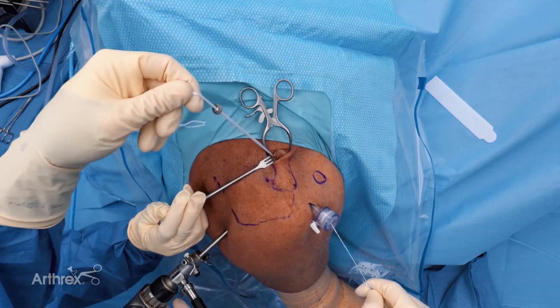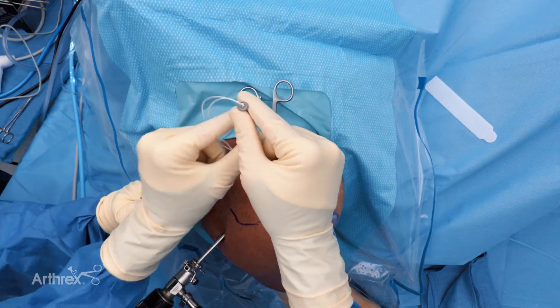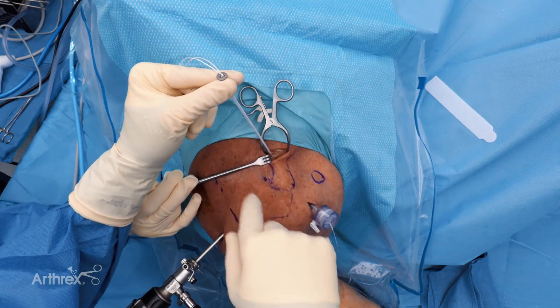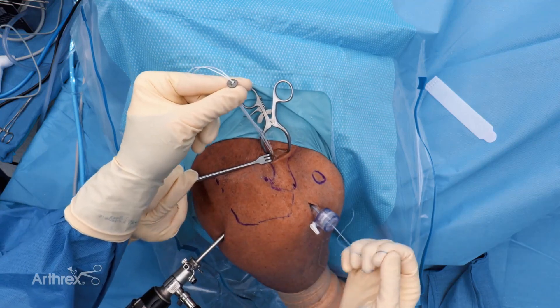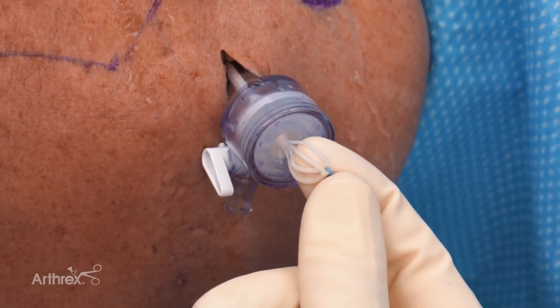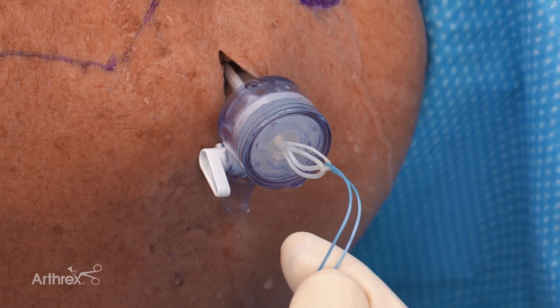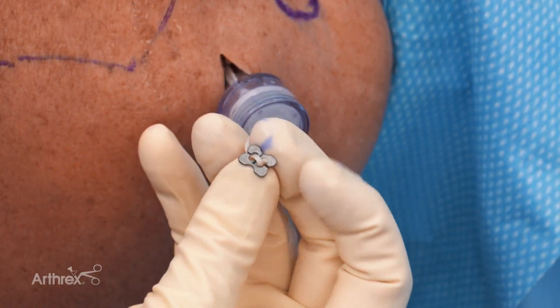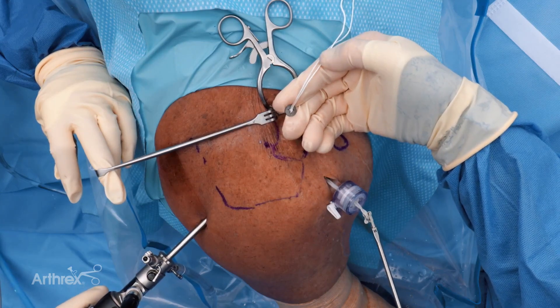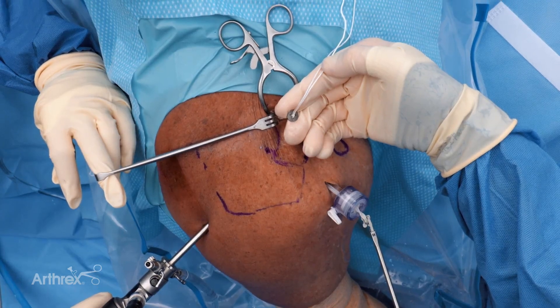What you want to make sure you're not doing is pulling on these sutures, because you don't want to close the button down and close your loop prematurely. I like to keep my fingers on the under surface of the button to maintain my loop length — it makes it much easier to handle. Once I've delivered my tightrope loop, this is where I assemble my dog bone. Once the tightrope is passed, this blue stitch can be cut off — it's no longer necessary. Now we have our dog bone assembled onto the tightrope loops and we're ready to deliver it through the cannula. Keep fingers under the clavicular button because you don't want to pull the strands and close the tightrope loop prematurely.